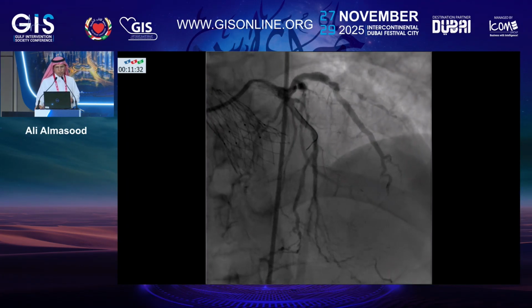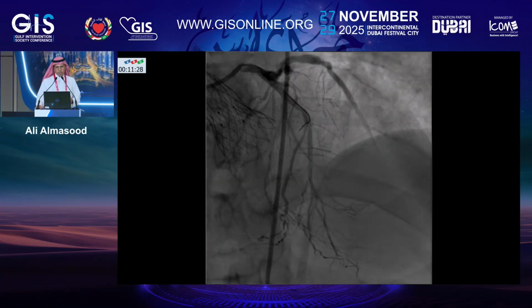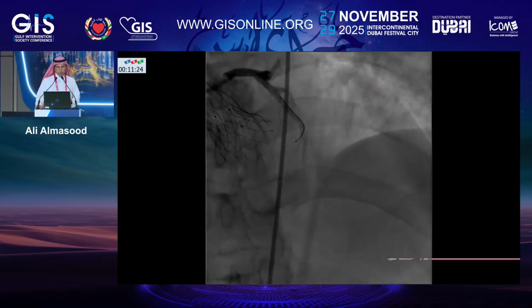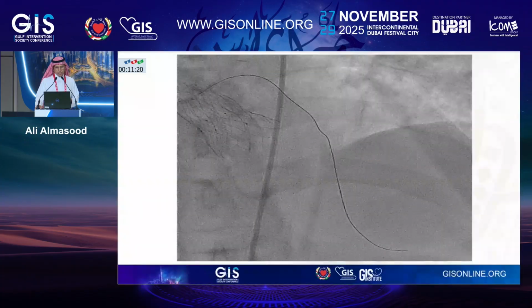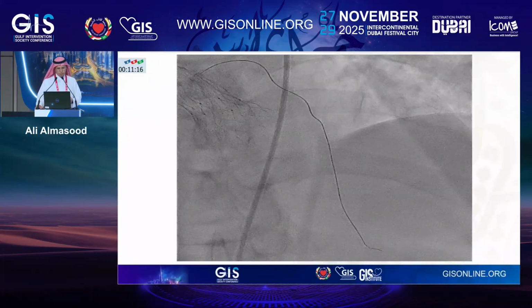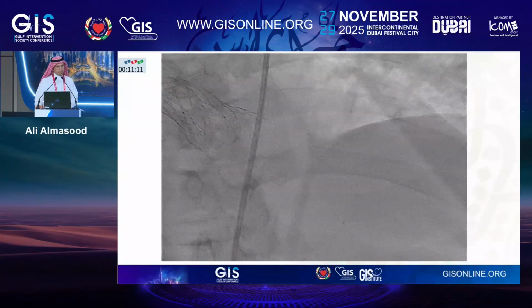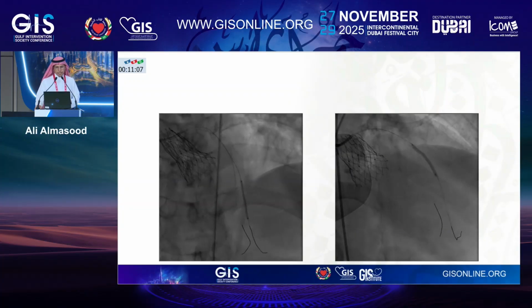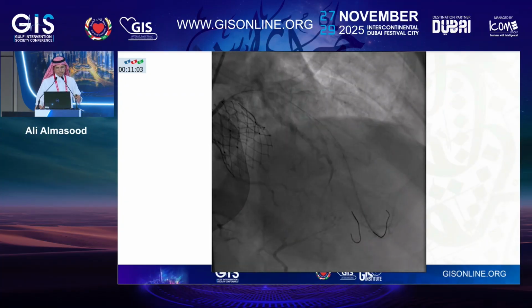So after deploying an Allegra valve to his calcific bicuspid aortic valve, we went ahead trying to address the LAD, which is chronically occluded for at least 3 years. So we used the contemporary measures to cross that lesion with specialty wires and microcatheter support, and then we double checked that we are in the distal vessel by microcatheter injection. Then we went ahead dilating this LAD, and I'd like to show you the immediate final result.